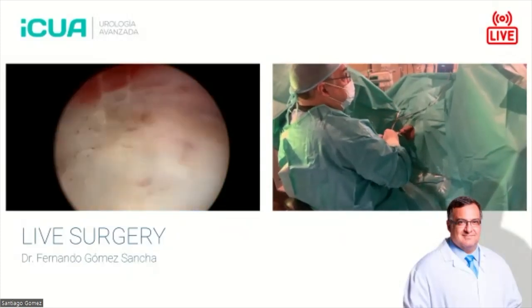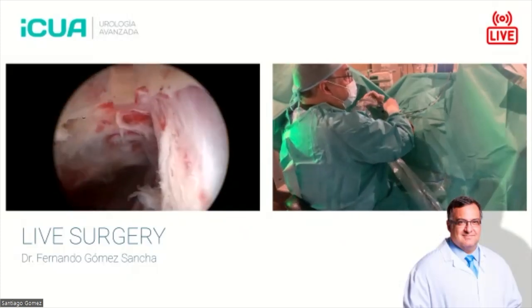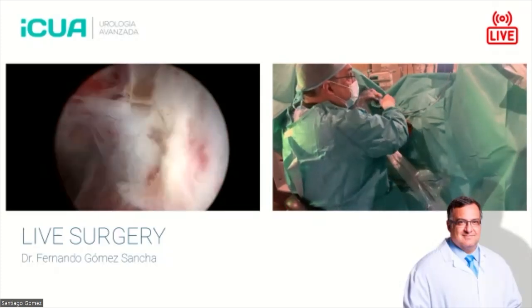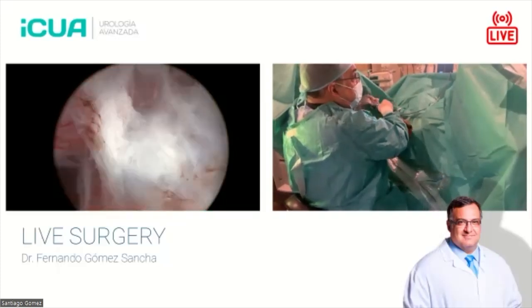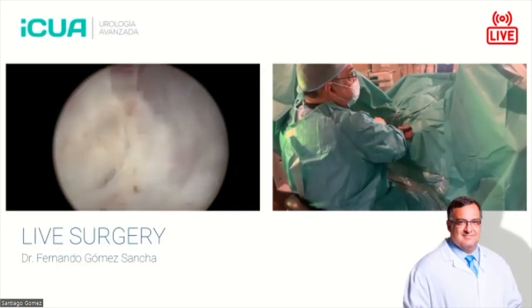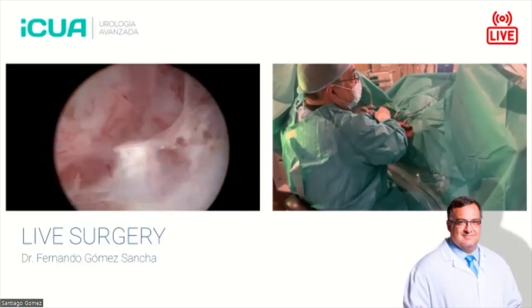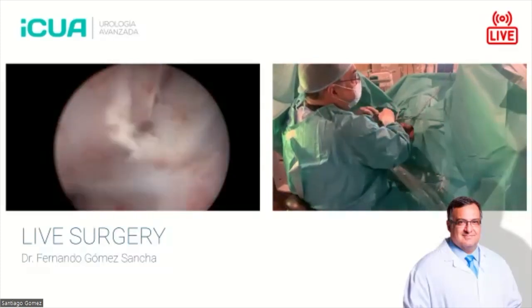So people tell me, oh, you're cutting on the adenoma. Well, I don't mind, because I can make a small cut, but then I'm going to look for the good plane here. So again, 2, 3, 4, 5, 6 millimeters up to enter the lateral plane, you see? And again, I'm going to do the mobilize and connect movements, mobilization of the apex, and try to connect with the line that we had performed posteriorly.